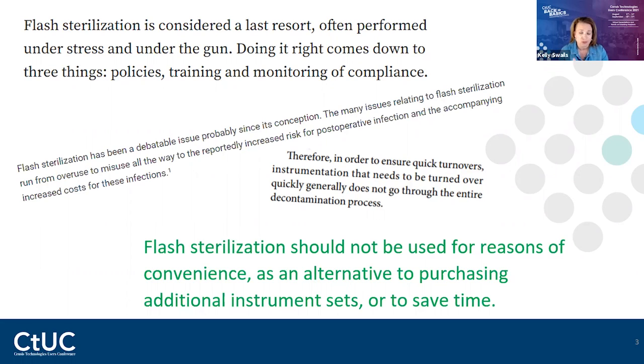And you have to really wonder, if an instrument's dropped or contaminated during the procedure and the patient's on the table, are they really going to wait while it goes down to decontam, goes through the sink for hand cleaning, and then goes into the washer, then comes to the IUSS sterilizer? So we're looking at least an hour between that mechanical washer and then into the sterilizer, and then back out to the field. And where it's cool enough, we usually just dunk it in cold water. Well, then we learned you couldn't do that because it's hard on the stainless steel, it will crack. Are they really going to allow a patient to just lay there on the table, put that OR at a standstill? So you have to question, is it being cleaned?